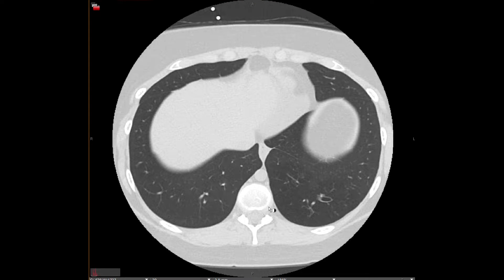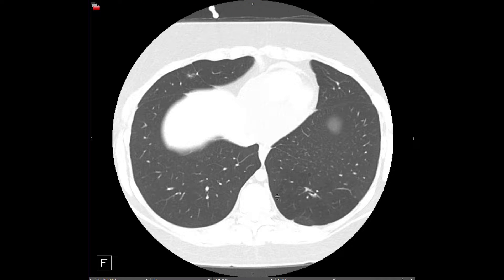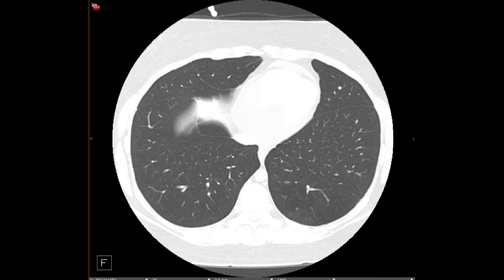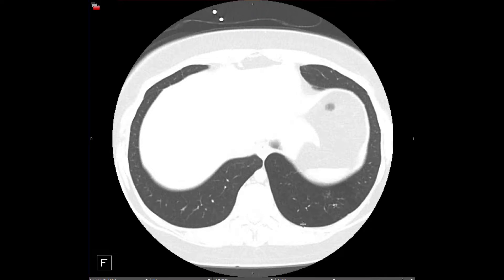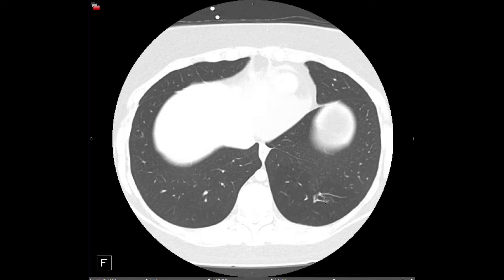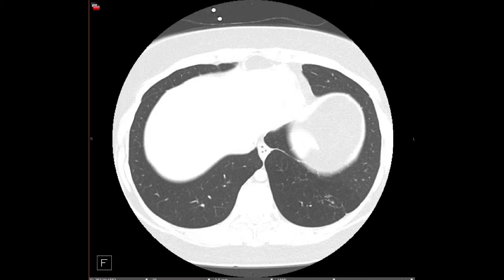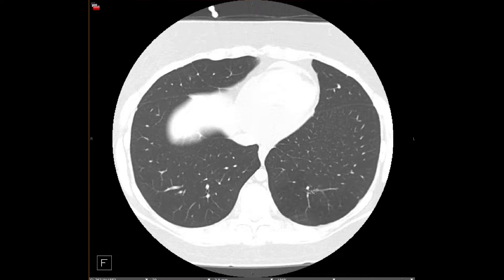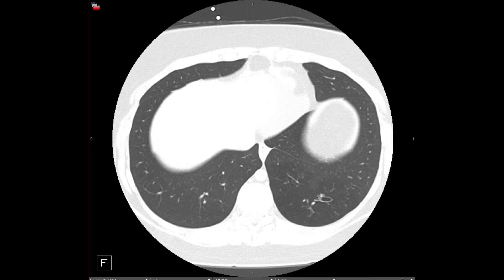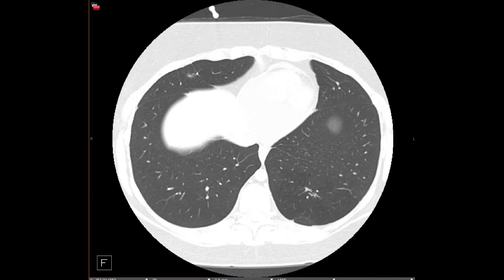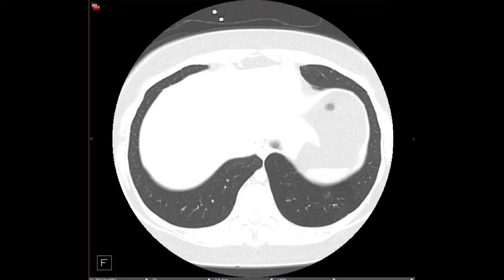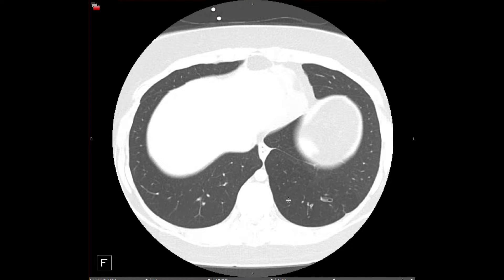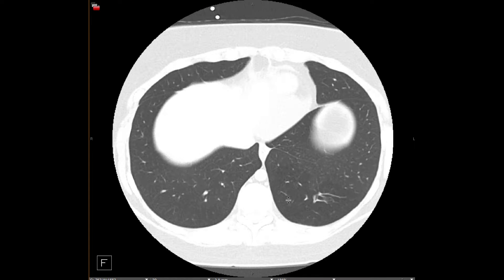Here within the left lower lobe we have an area of air trapping hyperlucency. In this case the central bronchus happens to be aerated, but you can see that it does not communicate with the central bronchial tree — the bronchus just abruptly ends here. So if you see an area of air trapping, you want to look for an obstructing lesion or bronchial atresia, and the key is to find either a mucus-impacted or aerated bronchus that does not communicate with the bronchial tree.